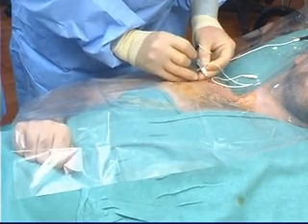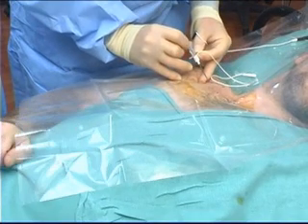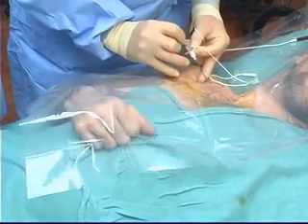Repeat this maneuver until the motor response remains constant during catheter advancement. Advance the catheter 3 to 5 centimeters beyond the needle tip, but not more than 5 centimeters. Remove the needle without disturbing the catheter.